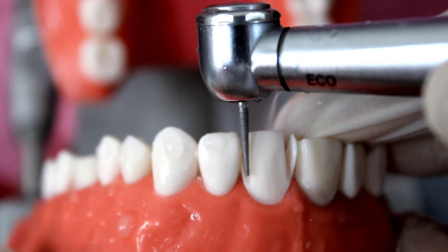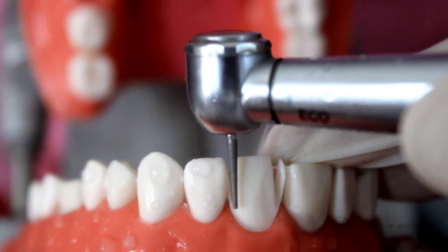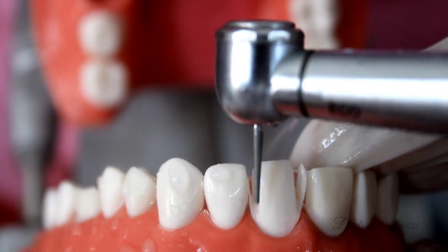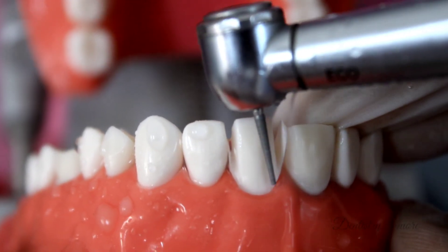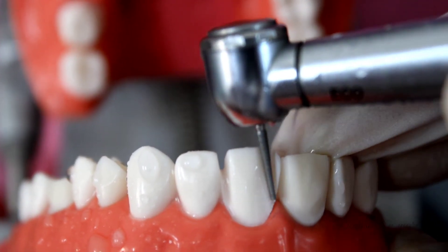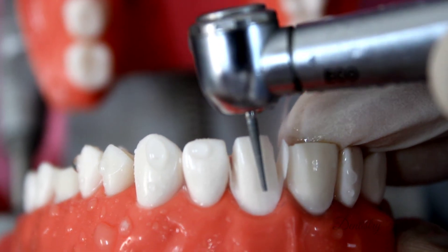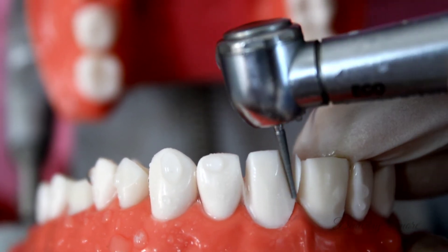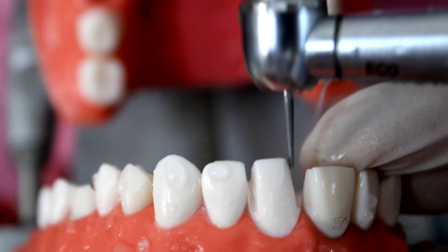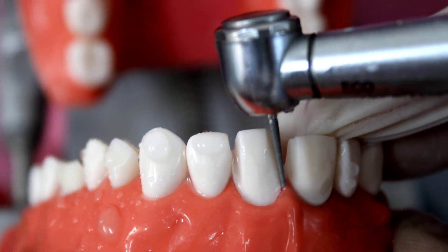That lip of enamel can be removed later using a hatchet or a probe. The needle diamond is always used in a vertical sawing motion with fine strokes and never kept in one single position. Once the contact point is broken using the needle diamond, we again use the flattened tapered diamond to connect the labial preparation to the interproximal preparation. There should be no step at the mesial or distal line angle — it should be a smooth, continuous transition from labial to interproximal.